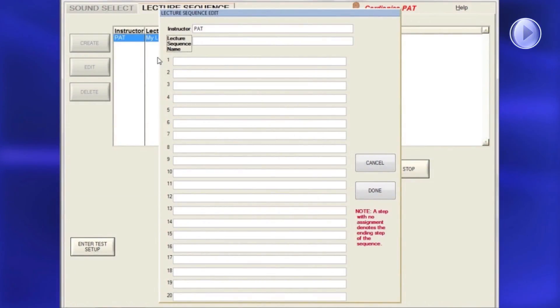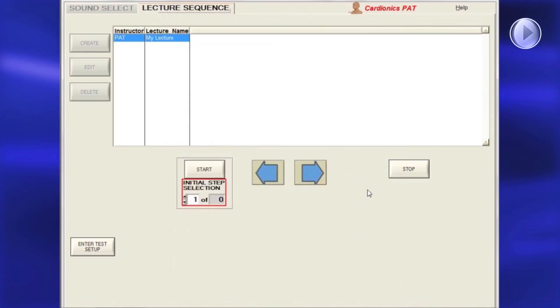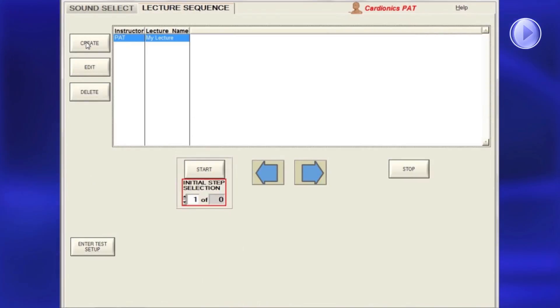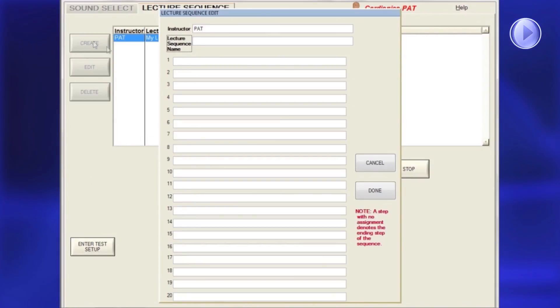Lecture sequences can be pre-programmed and instructors may have multiple lectures with different names. To set up a lecture on the Lecture Sequence page, click Create to bring up the Create Lecture page.